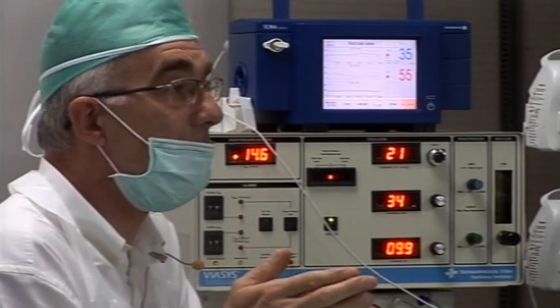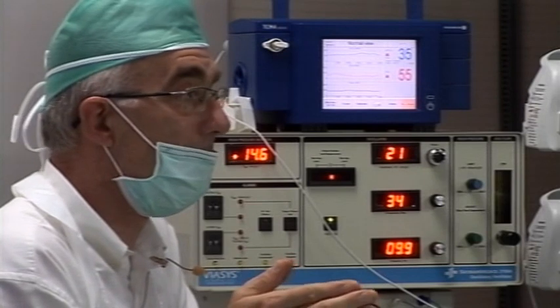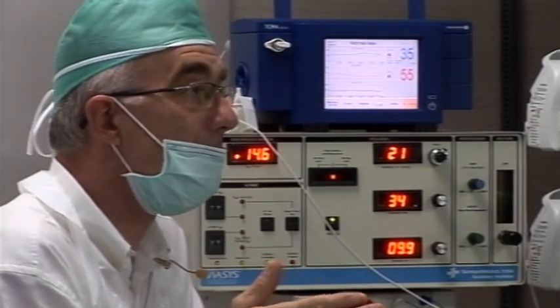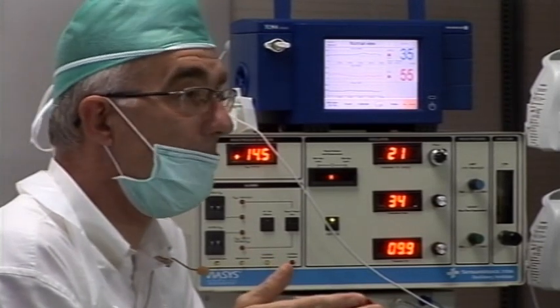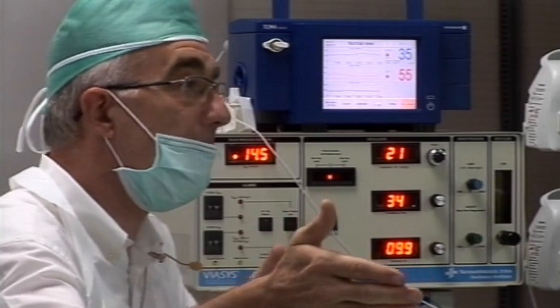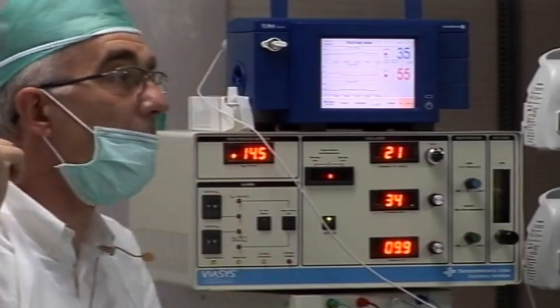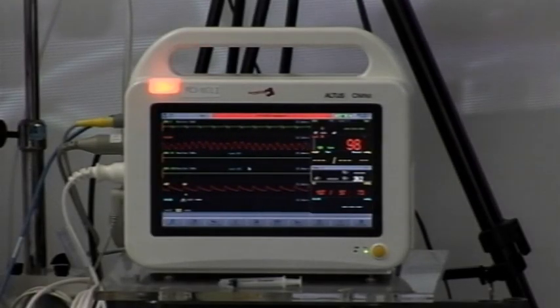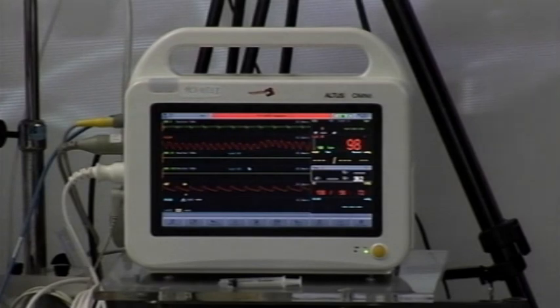We needed 33 to be in 21% oxygen. We needed 33 to open the lungs correctly. He was extremely sick. So 33 doesn't overdistend, like 7 can overdistend. It depends on the compliance. You don't have the possibility of measuring compliance, so the only parameter that you have is oxygenation. You overdistend, oxygenation is decreasing.